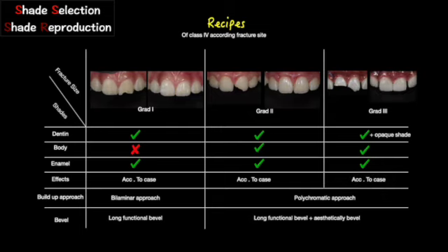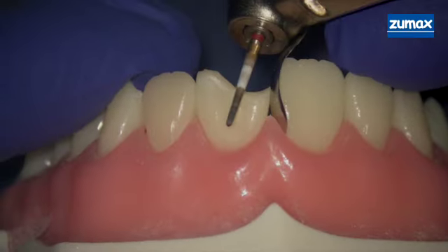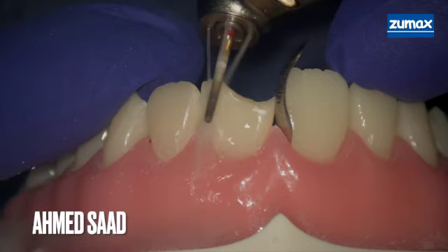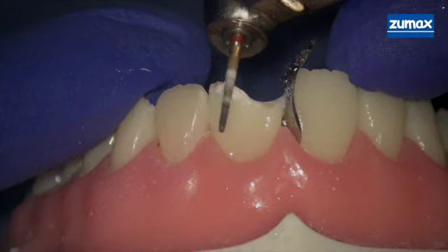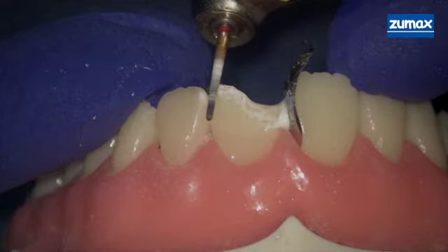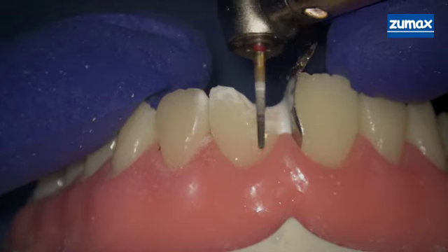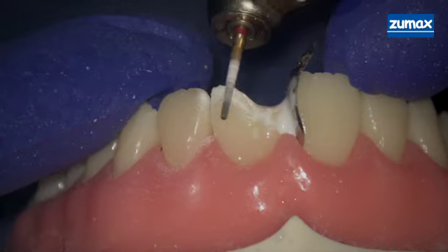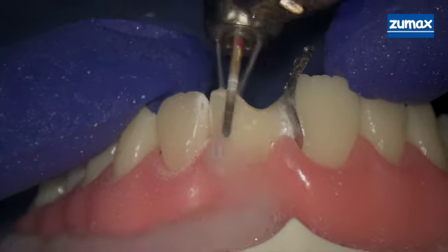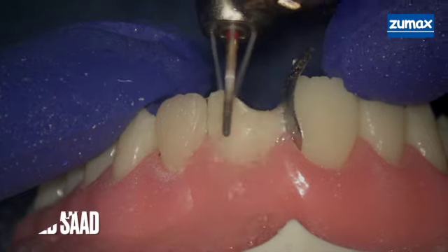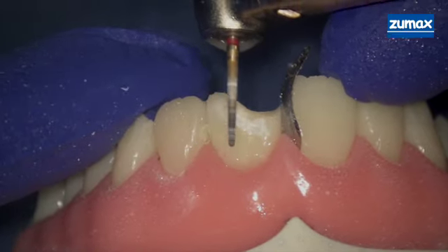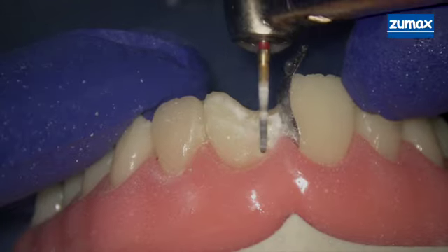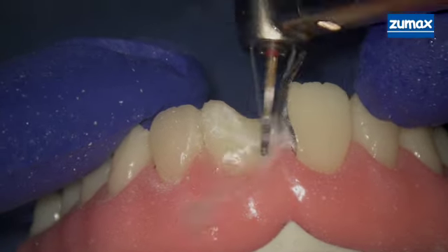According to my classification, my bevel design will be functional and aesthetic. I will start using a red-coded finishing bur at 45 degrees, just 1 to 2 millimeters from the fracture side to the labial, and on the labial side to remove only 0.5 to 1 millimeter thickness maximum. This is our functional bevel. Don't forget to use a matrix guard to prevent adjacent tooth injury, and don't forget to use coolant during preparation to avoid heat generation.